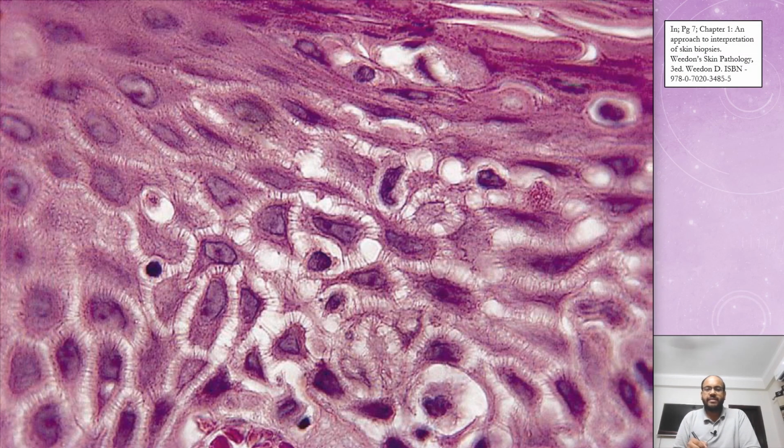In this picture, you can see the spinous layer very easily. There's also an additional pathological finding of spongiosis, but let's just focus on the spines that you can see. Let me change the color again. Can you see this as the keratinocyte, and these are the spinous processes? These are all the areas where the cell is attached to its neighbor cells, which has not retracted because of desmosomes, giving it a spinous appearance. That is why stratum spinosum. Okay, let's move forward.